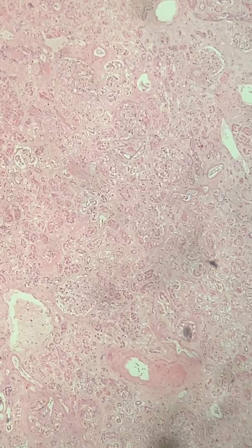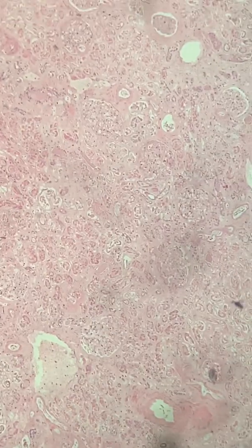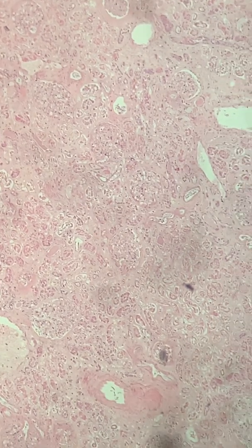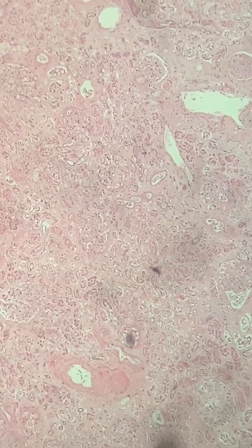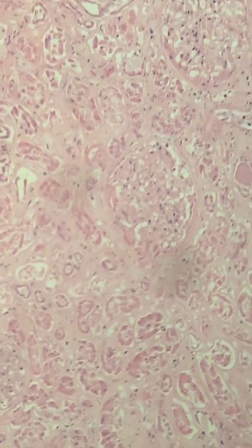Now, this is the kidney. The person had a history of hypertension, but I think it was probably very well controlled based on some of the clinical data that I saw. But you can see relatively nicely intact glomeruli, and as I go closer, most of the surrounding tubules are necrotic. So this is acute tubular necrosis, but I'm just going to go and show you. Otherwise, this kidney looks very good.